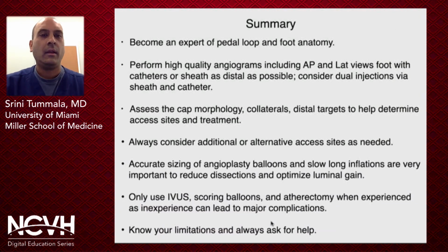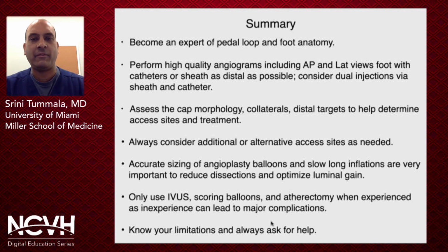So in summary, become an expert of pedal loop and foot anatomy. That is the key to a lot of these interventions. Perform high-quality angiograms, including AP and lateral views of the foot with catheters or sheaths as distal as possible, and consider dual injections via the sheath and maybe via a catheter that's in one of the tibial vessels to really optimize the visualization of caps and collaterals and distal targets, because this will help to really determine your access sites and treatment. Always consider additional or alternative access sites.